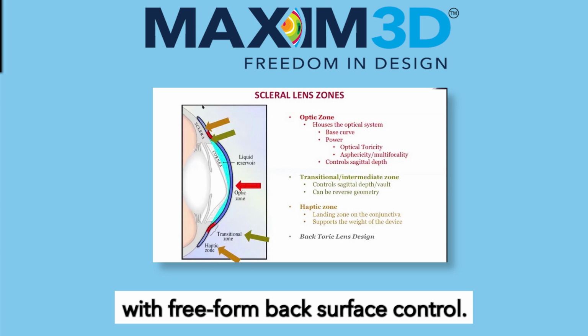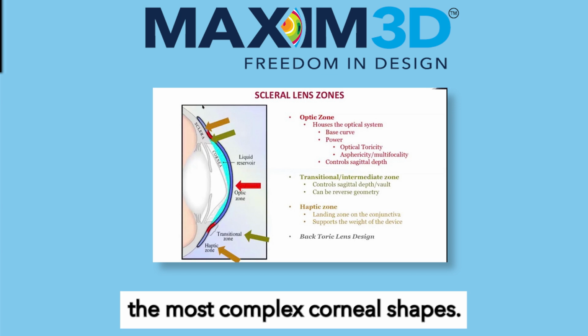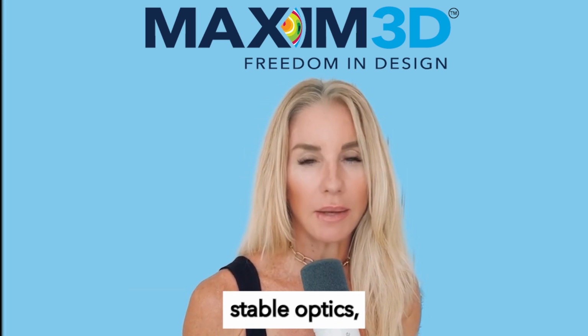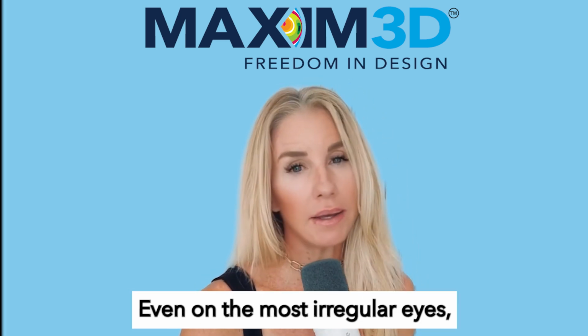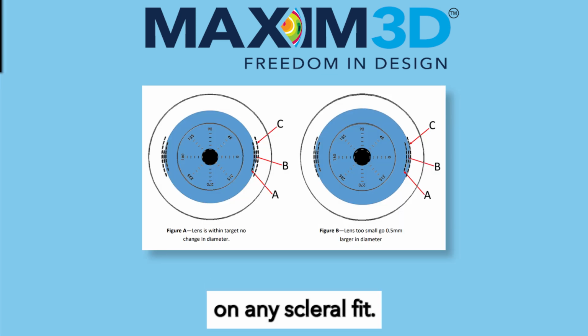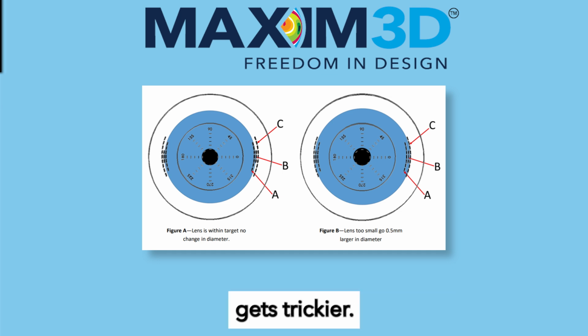With free-form back surface control, every zone of the lens can be tailored to match the most complex corneal shapes. That means precision alignment, stable optics, and comfortable wear, even on the most irregular eyes. Start the same way you would on any scleral fit, by selecting the correct diameter. From there, choosing a trial lens gets trickier.